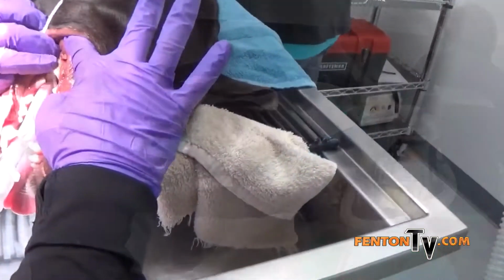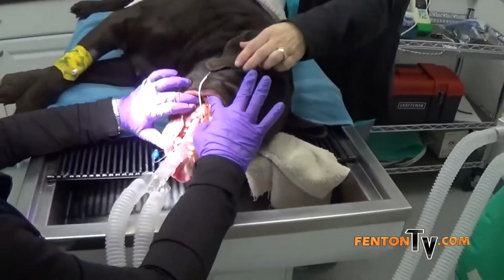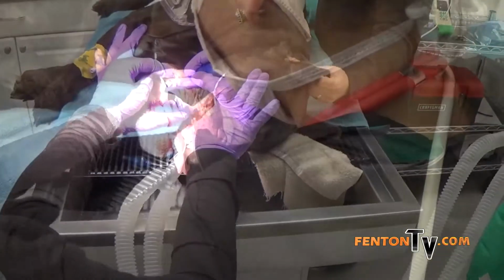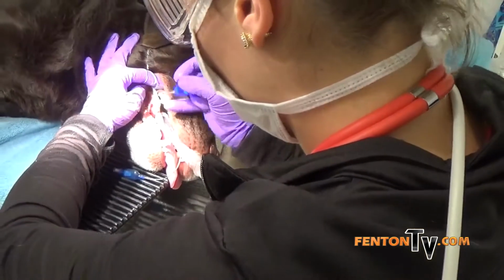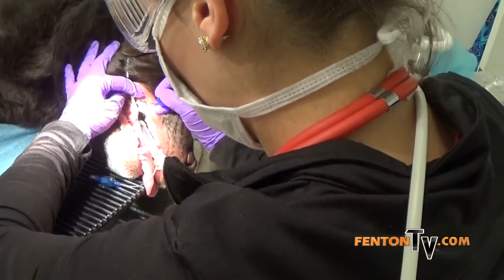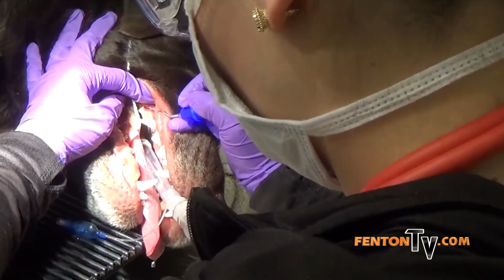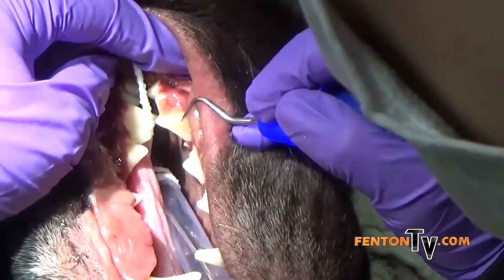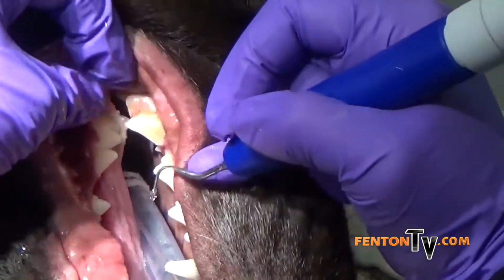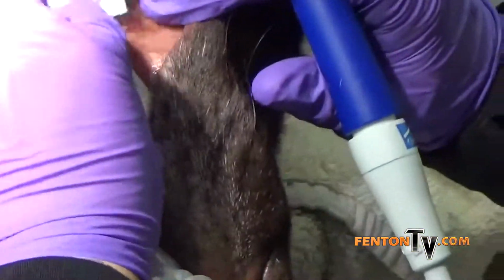To the other one, so you can see the tartar built up there, and we are going to remove that. And just like us when we don't floss, our gums bleed a little bit.